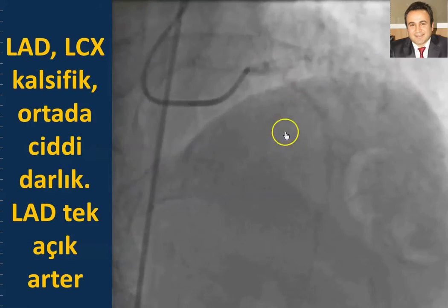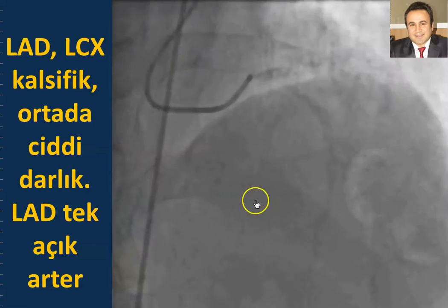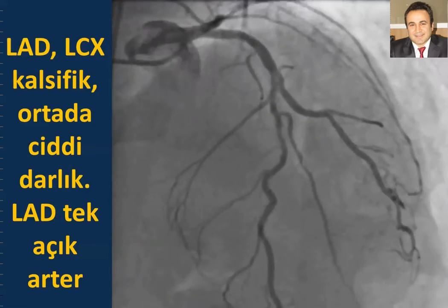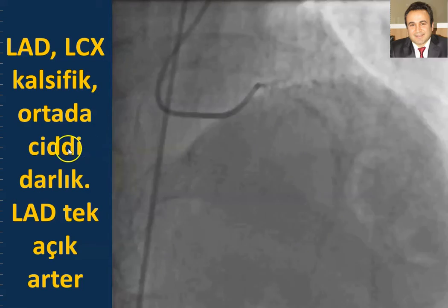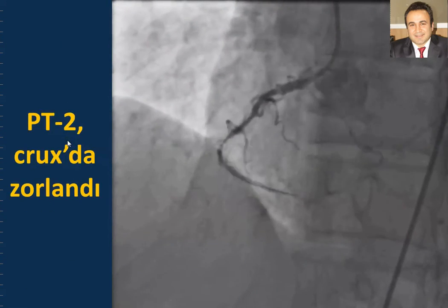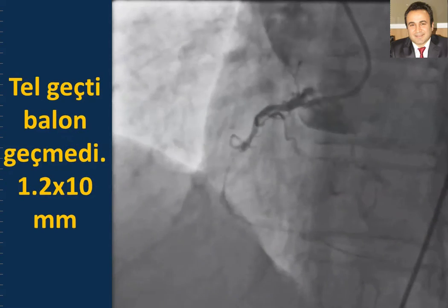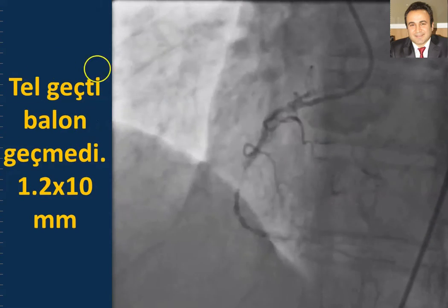There is a significant lesion in the LAD with severe calcification. This was the only open artery. This is a PT2 hydrophilic guide wire.